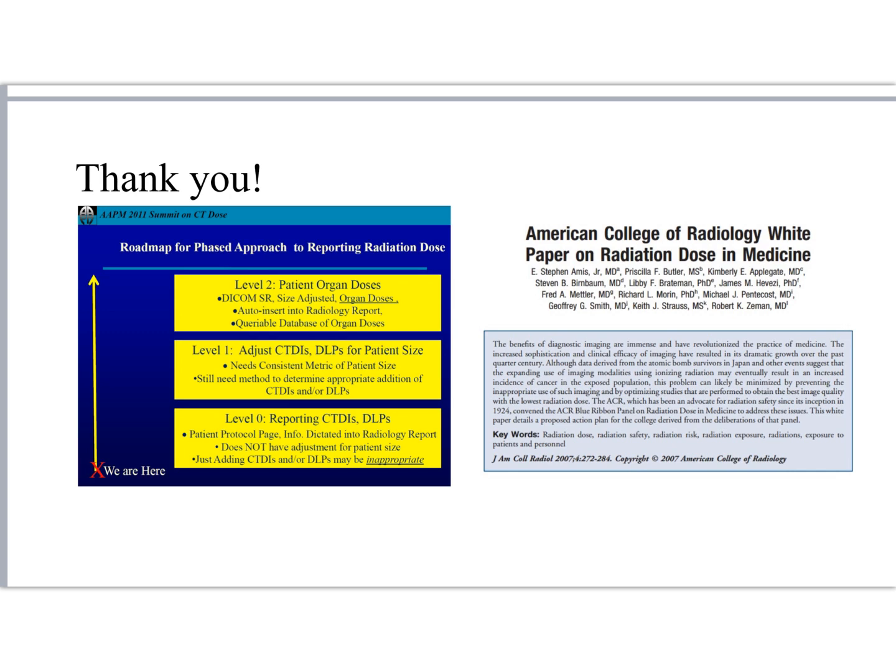So I'm just going to refer people back to the summit on CT dose. Helpful stuff. You'll notice we are really far down on their estimation of how well we're doing with CT. We haven't even really started. We're at level 0. We're not reporting this stuff. We don't have a database, etc. This is clearly something that needs to be on the forefront of people's minds.